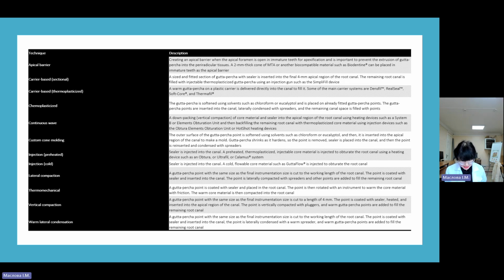Endodontic hydraulic sealers are hydrophilic, setting by reaction with water. They are dimensionally sound, expand on setting and have excellent properties for root canal sealing. However, their dimensional stability is dependent on their environment, as drying out will lead to shrinkage.